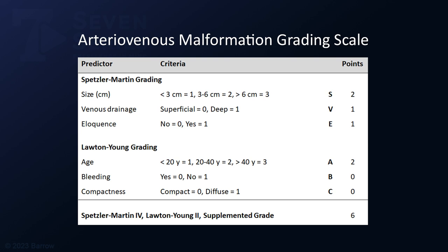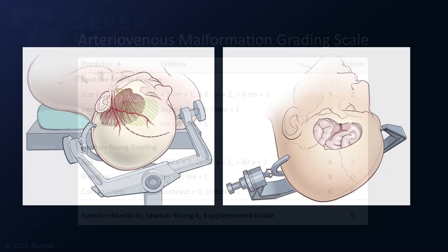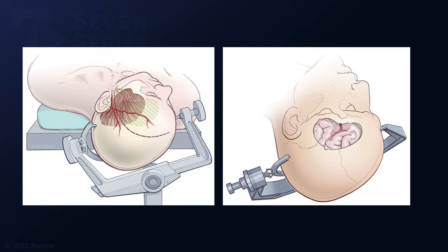This grading shows that there is a mismatch between the Spetzler-Martin and the Lawton-Young grades. A left pterional craniotomy was selected. The patient position, skin incision, and craniotomy are shown here.